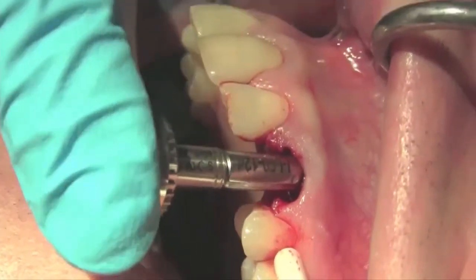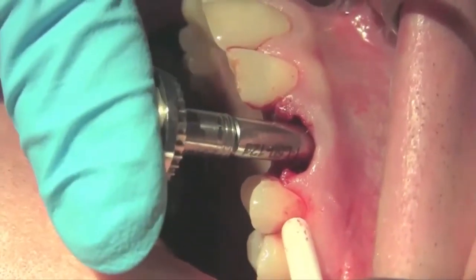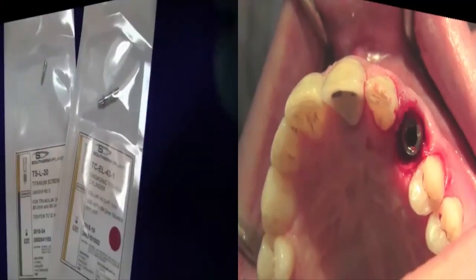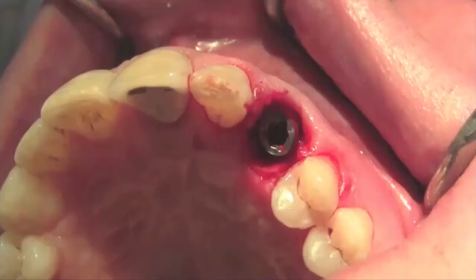So at this point, we're going by hand and with the ratchet adjusting the depth and the position of that implant, which we have achieved. I also would like you to pay attention to the gap between the palatal bone table and the implant platform, the mesial table and the implant platform, the facial and the mesial.